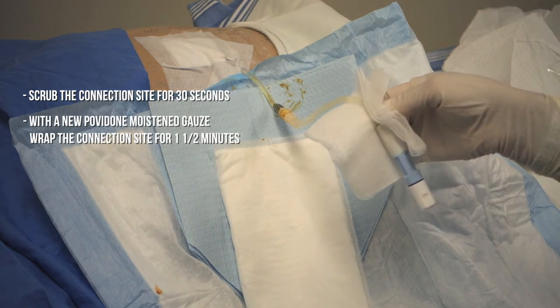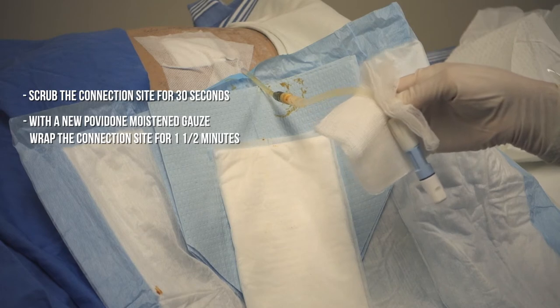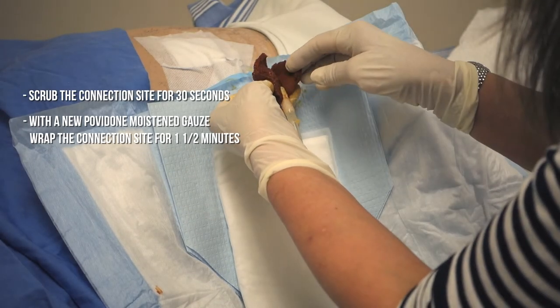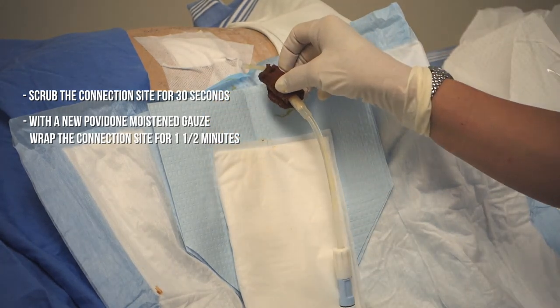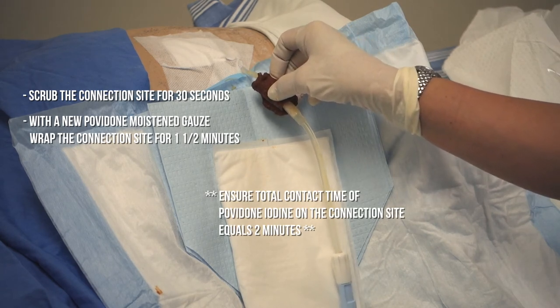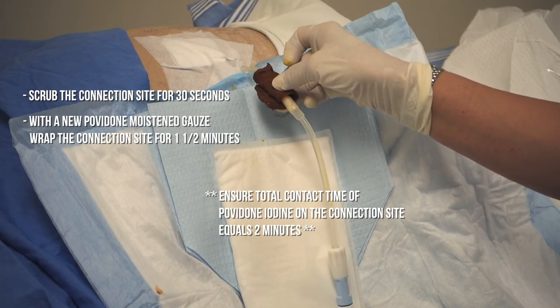Then you will take another gauze moistened with povidone iodine and you will wrap it around the connection site for one and a half minutes. You will need a total contact time of povidone iodine with the connection site of 2 minutes — 30 seconds for scrubbing and one and a half minutes contact time with the gauze.